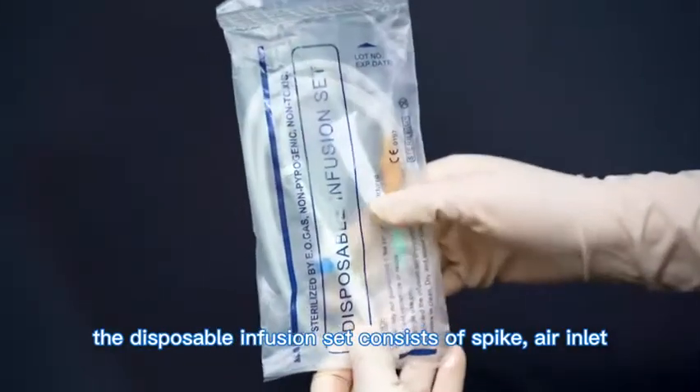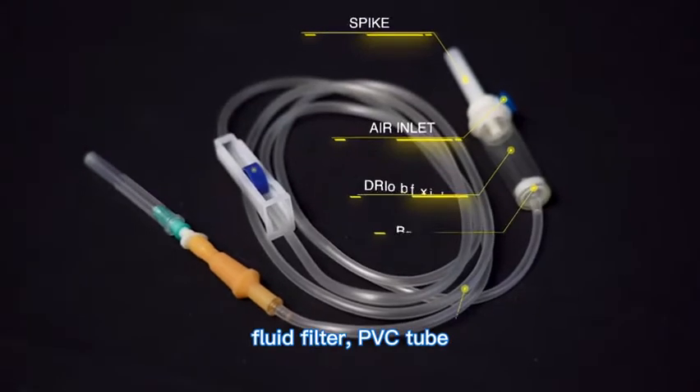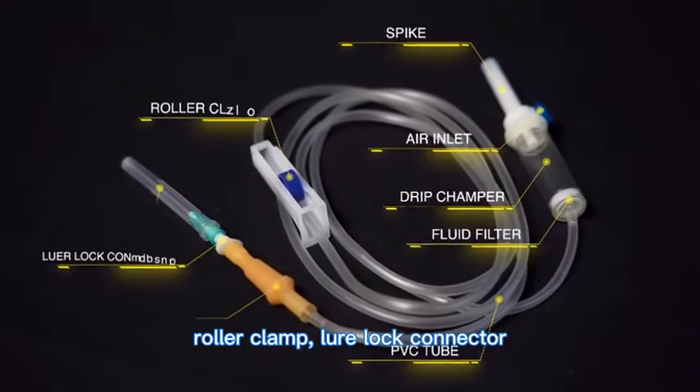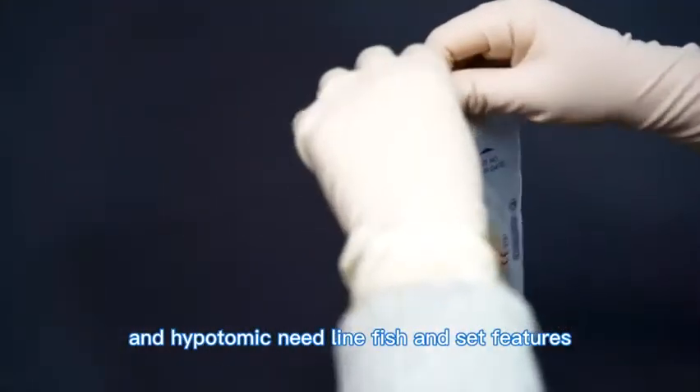The disposable infusion set consists of: spike, air inlet, drip chamber, fluid filter, PVC tube, roller clamp, Luer lock connector, latex tube, and hypodermic needle. The infusion set features the following qualities.